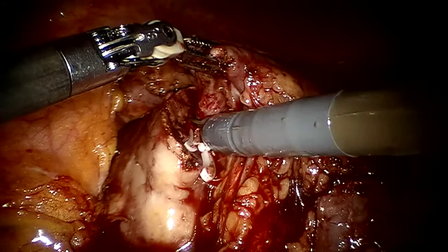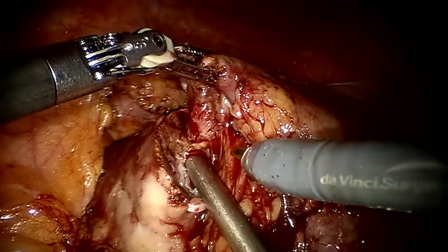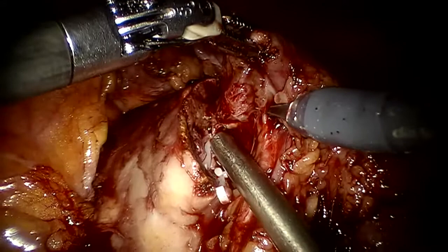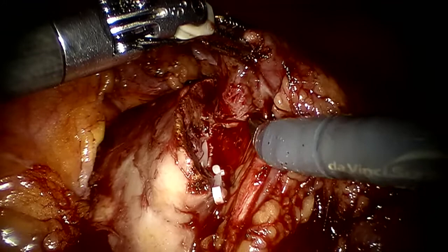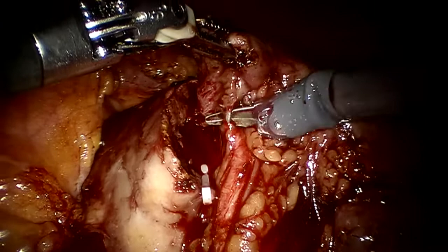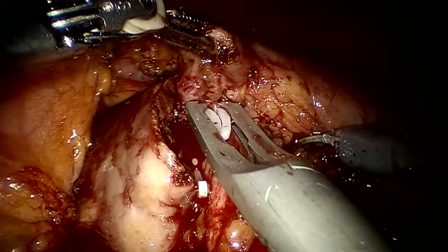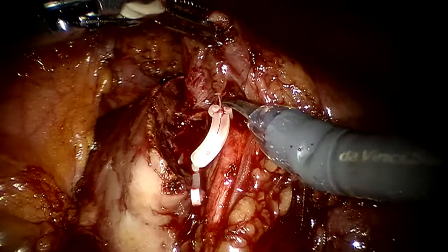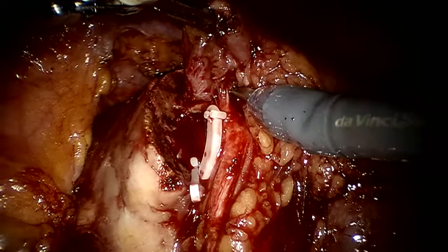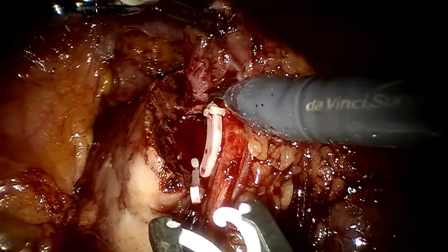Okay. So let's see. So this is going straight in here, right? Good, right, just that. Hit it. Good. Come on out. Come on. Perfect. Sorry. This is going straight in too. Right, you agree? This is going straight to the tumor too, right here. So just take that branch. We may need to take this entire artery, but not right now.